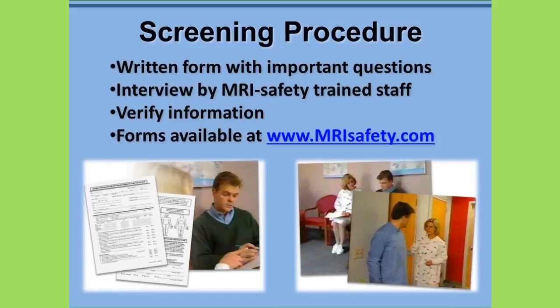The Institute for Magnetic Resonance Safety Education and Research developed two separate forms for the purpose of MRI screening, one for patients and one for other individuals that may need to enter the MRI setting. These forms are available to your facility and can be downloaded from the website, MRIsafety.com.